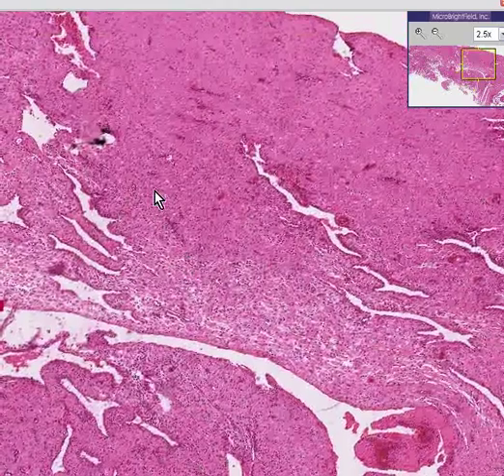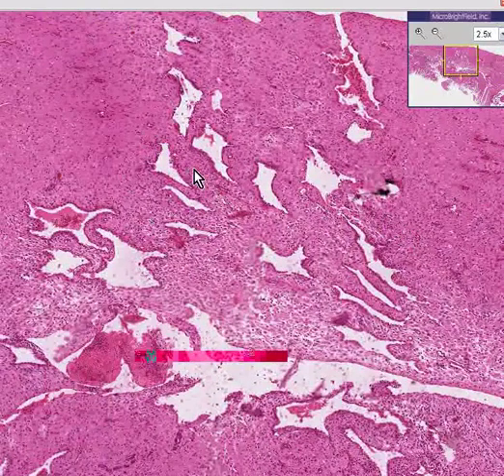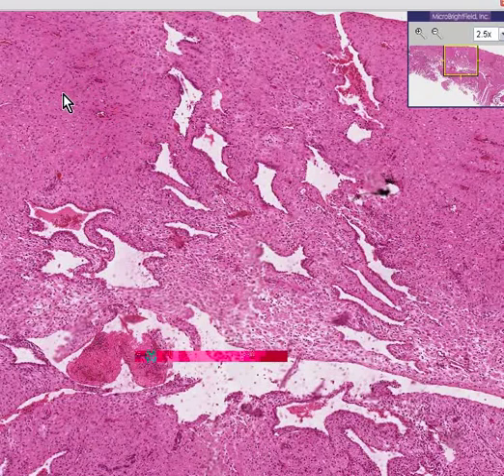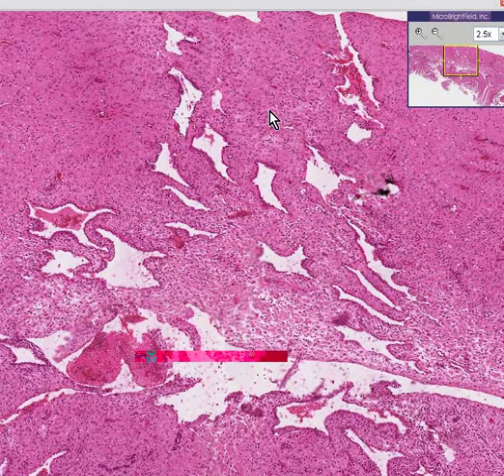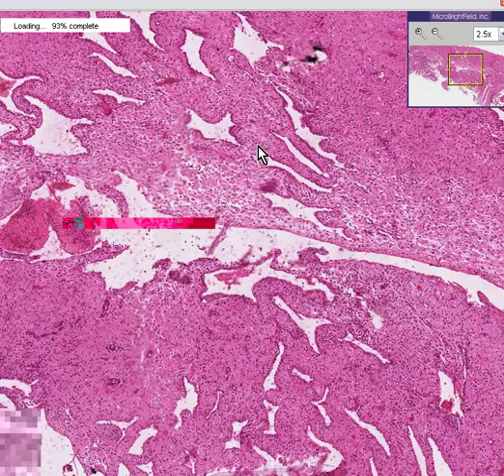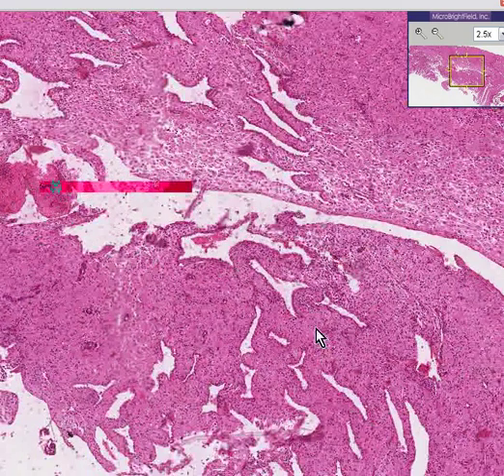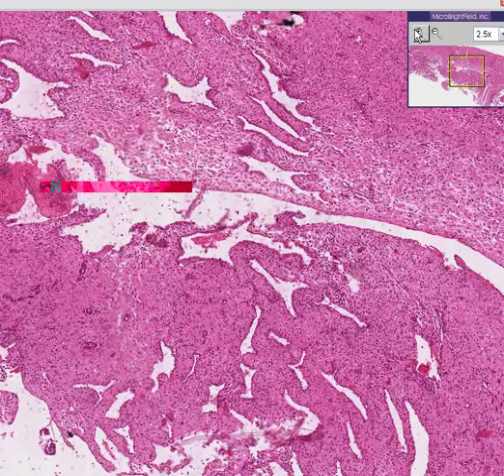Normally in an endometrium, you see about an equal amount of stroma, which is the connective tissue between the endometrial glands, as you see glands. And here, you see perhaps 90% stroma and a relatively small amount of glands.